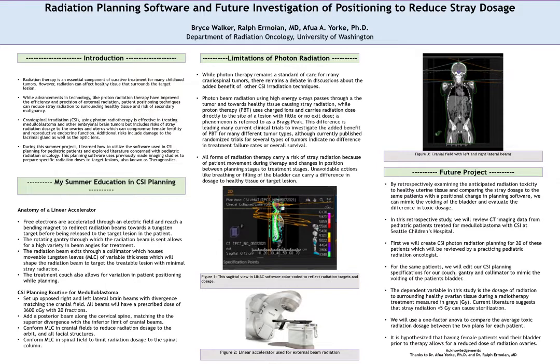So patients are taken for a preliminary CT scan, sometimes an MRI. The scan will be viewed in a software, in this case on Citrix, called RayStation. Radiation oncologists will plan their treatment through that from that preliminary CT scan. And then when they return for radiotherapy, they'll be placed in the exact same position for treatment. So it helps to understand how radiotherapy works, to understand the secondary problems that can come with treatment.